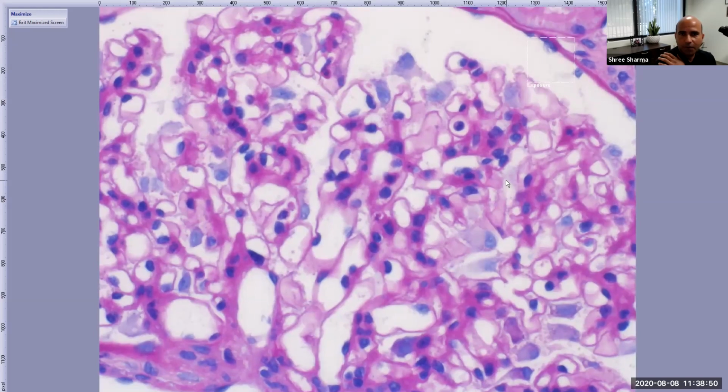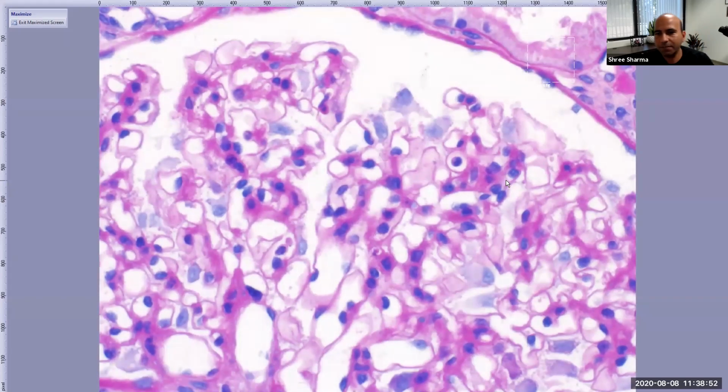Let's have some tools to approach kidney morphology when you are alone, because as a fellow, that is very important. We went over the morphology of the glomerulus. This is the mesangial area, and I'm seeing the loops. Those purple cells floating around on their own should be visceral epithelial cells, because outside the GBM in the normal scenario there should be visceral epithelial cells.